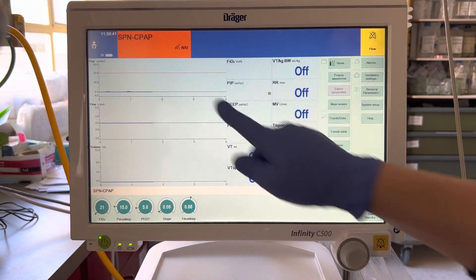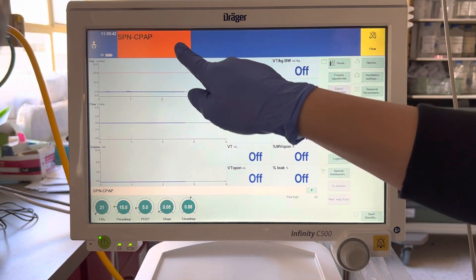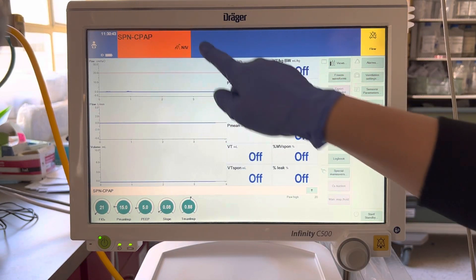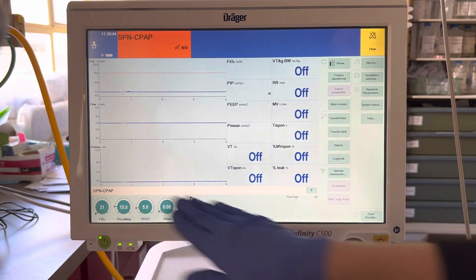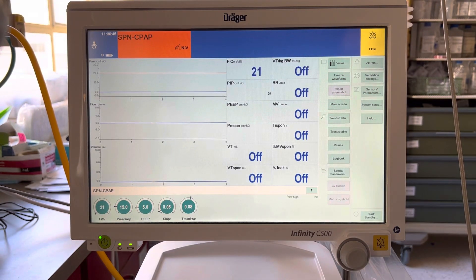Now you're in CPAP mode — you can see CPAP displayed in orange along with all your settings. That's it.